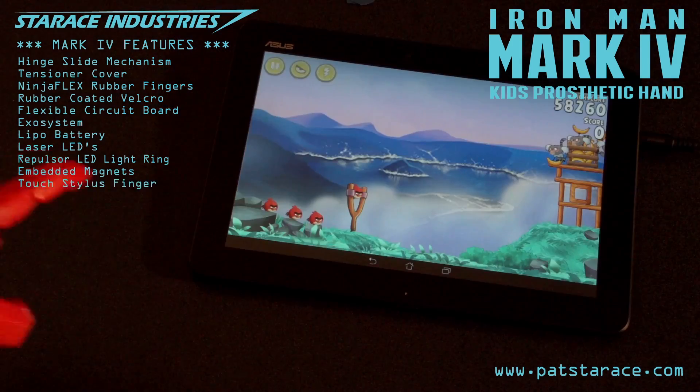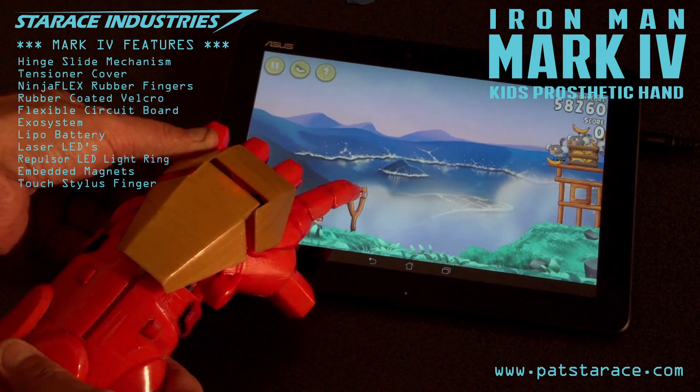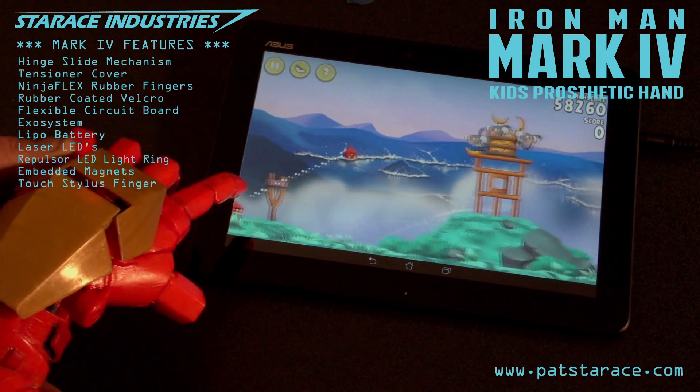Capacitance finger test. Yes sir. I finished it when you were sleeping. The touch stylus can be used on any mobile touch device.